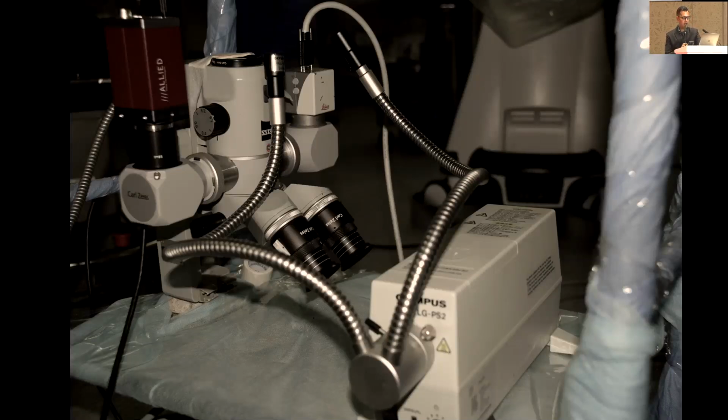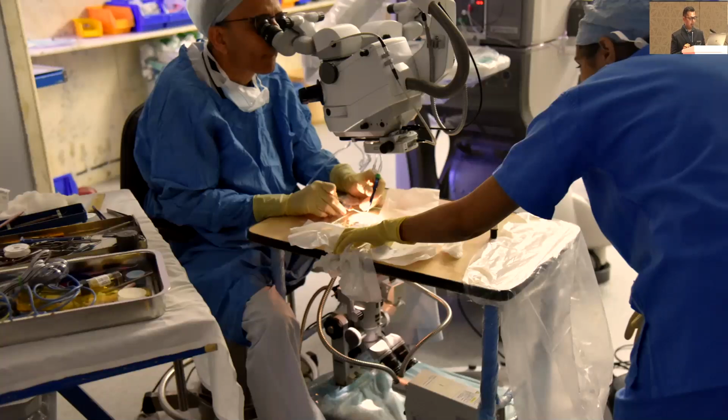We found a very nice old operating microscope, and we decided to break it apart and mount it upside down on a table. So as you can see, there's a Zeiss microscope that's mounted upside down, which has a camera, including both a regular and a high-speed camera. So the idea is to use a sectioned cadaveric eye, stick it half onto a slide, operate from the top as you would do a cataract surgery or any other ocular IOL fixation, and to record the surgery from the bottom to see what's happening inside the eye when it's being done and what the outcome is like.